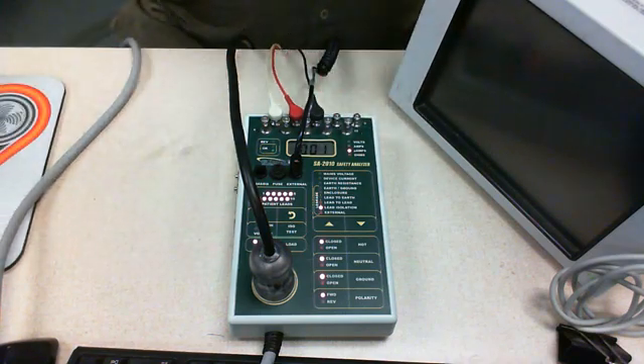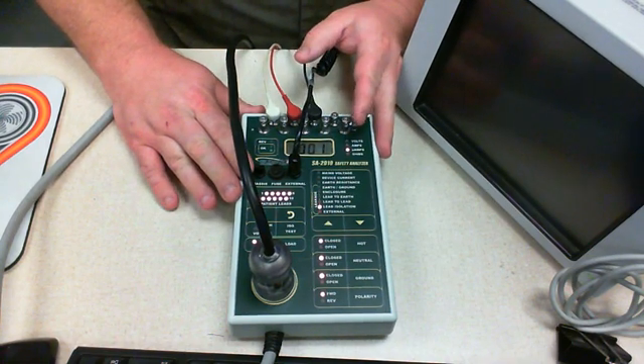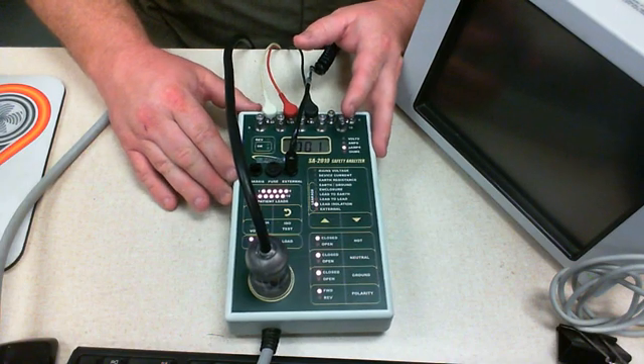In the first part, what I'd like to do is focus on the electrical safety side of things. I'm going to do these checks with the device off.